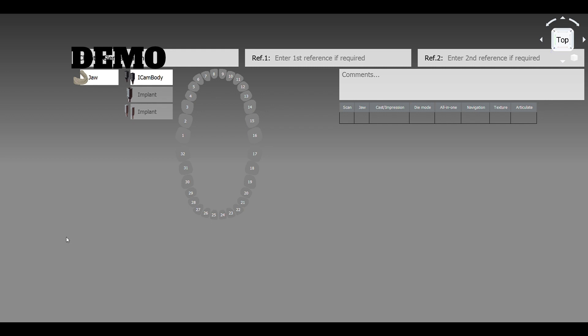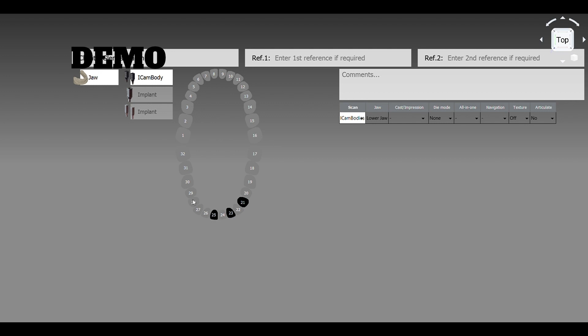So what we do is, it doesn't matter which arch you start with, so let's just go in. Since we're doing the lower, it's 20, 23, 25, 28. You see how it pops up right over there on that side.